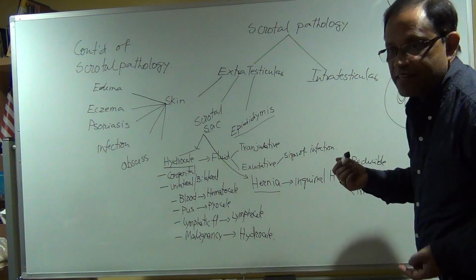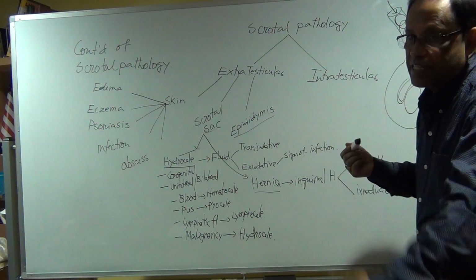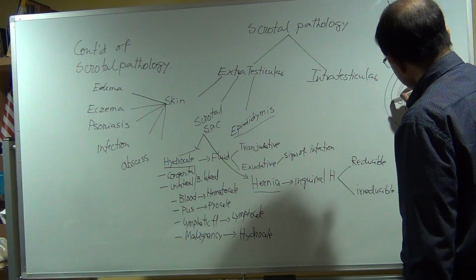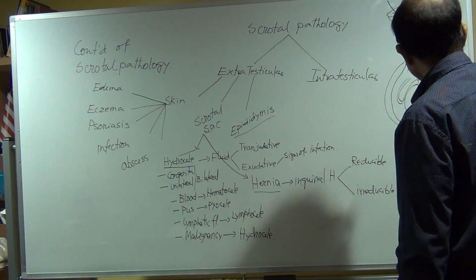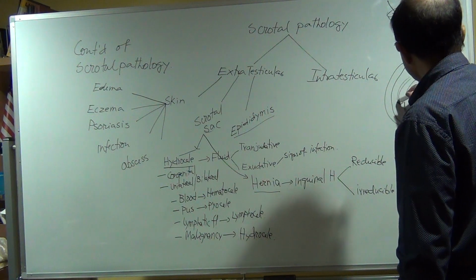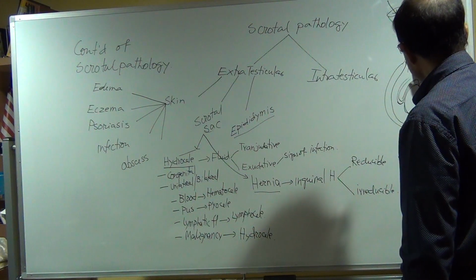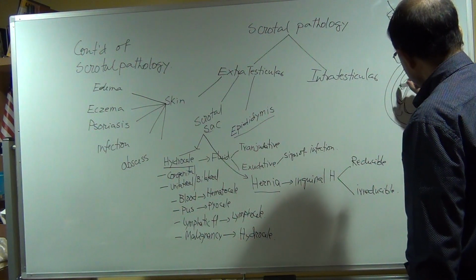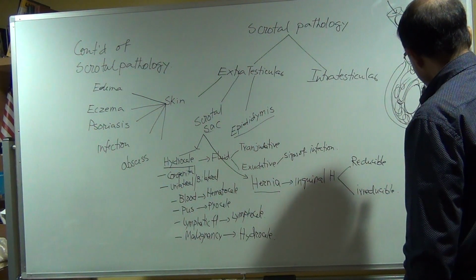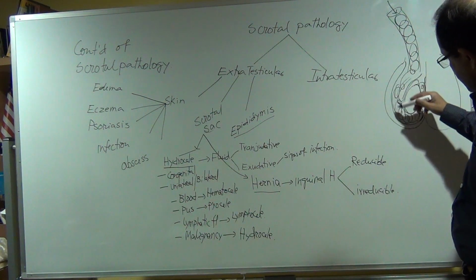And in the wall of the intestine, you will see the multi-layer. If it is fat, you will see the fat echogenicity. So now these things will come, and look here. You will see other than the testis and epididymis, there is something in the scrotum.